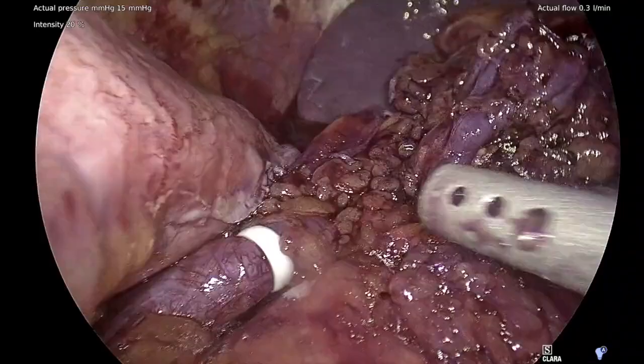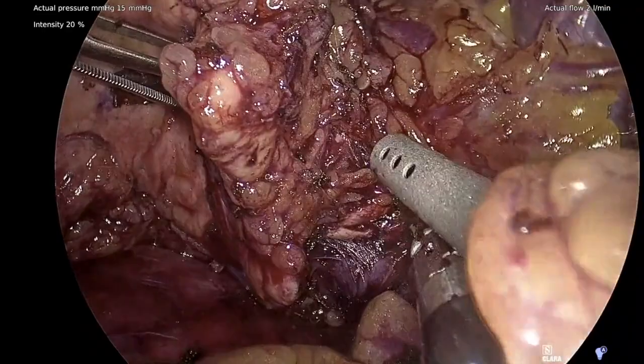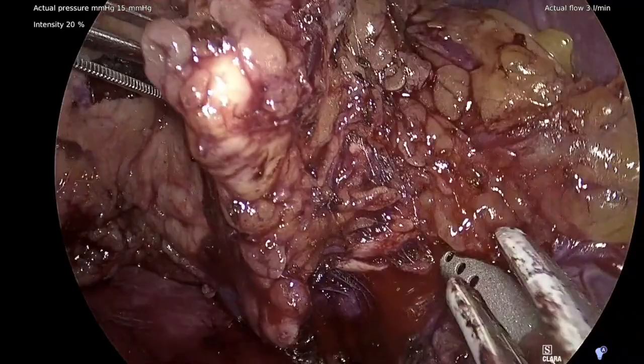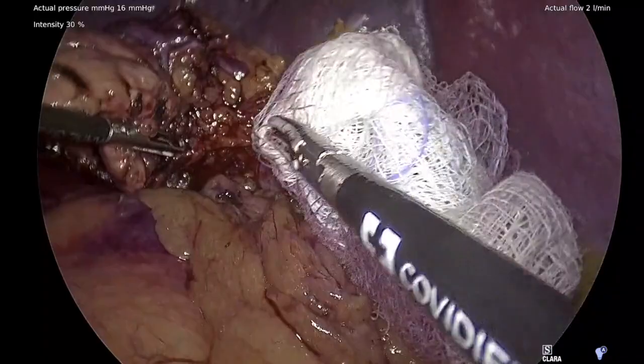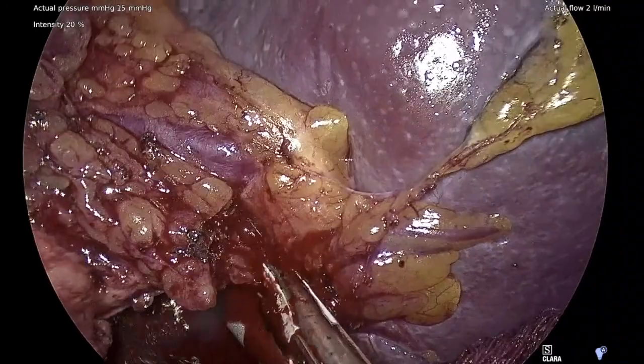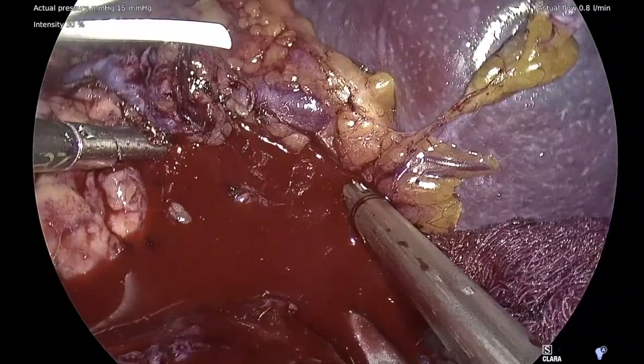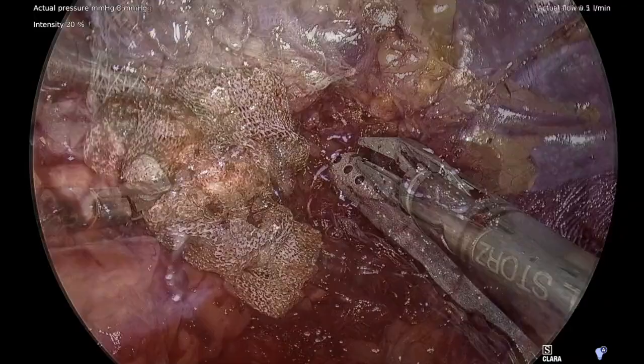The dissection is continued to divide dense adhesions from the distal pancreas to the spleen. Given the close adherence of these pancreatic adhesions to the splenic hilum, a small amount of bleeding was encountered while dissecting with the bipolar shears. This bleeding was controlled through direct pressure with the suction, in addition to the placement of a sponge into the abdominal cavity. After attaining initial hemostasis, brisk bleeding was then noted from the area of the splenic hilum. This was attempted to be controlled through the deployment of an endoscopic clip. Given ongoing bleeding despite the clip, direct pressure was again applied using the sponge. A cellulose-based hemostatic agent was then applied in an attempt to attain additional hemostasis.